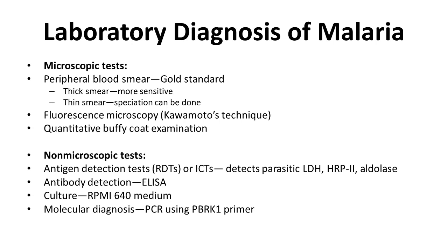But in the case of Plasmodium falciparum and Plasmodium malariae, the red cell size is the same as the normal red cell size, and the color is a little bit pale compared with the normal RBC.